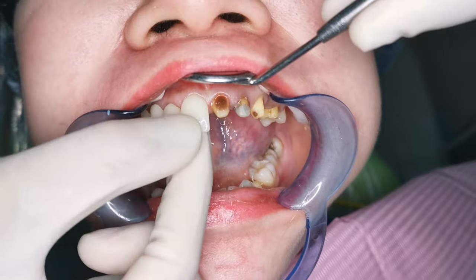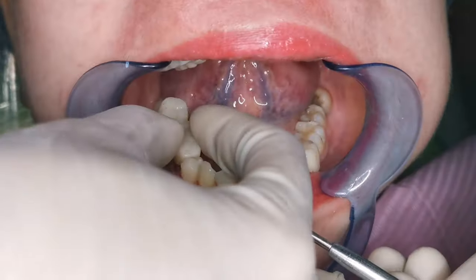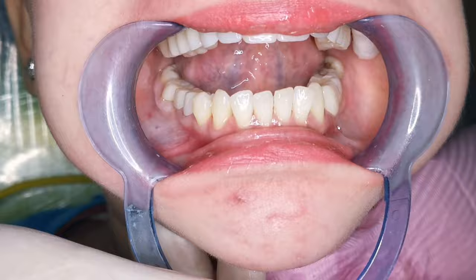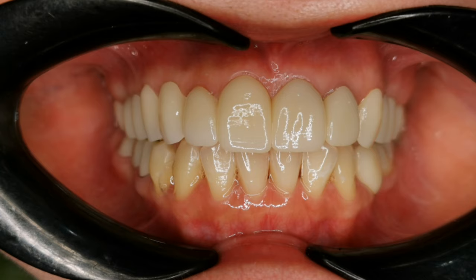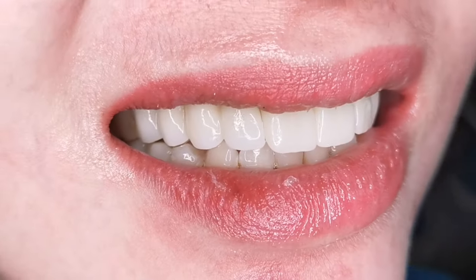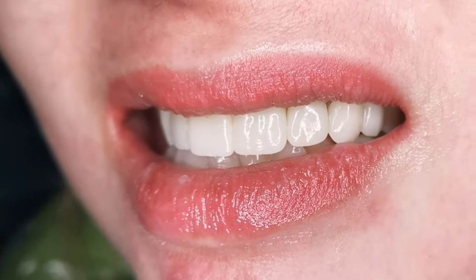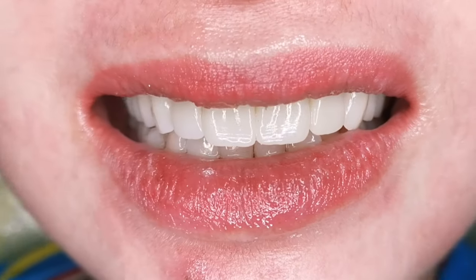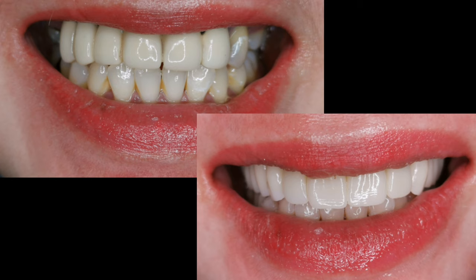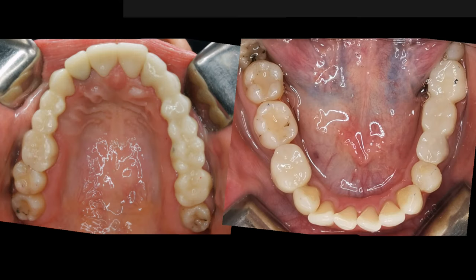Now I'm trying in the crowns to check the fitting and to let her see the crowns first before I permanently cement them. My favorite moment — the smile reveal. Ready? A very big difference with her smile before and now. No more black lines at the gum line because zirconia crowns are metal-free. She can now eat on both sides of her jaw and smile confidently more than ever. We've done another sherrific smile.